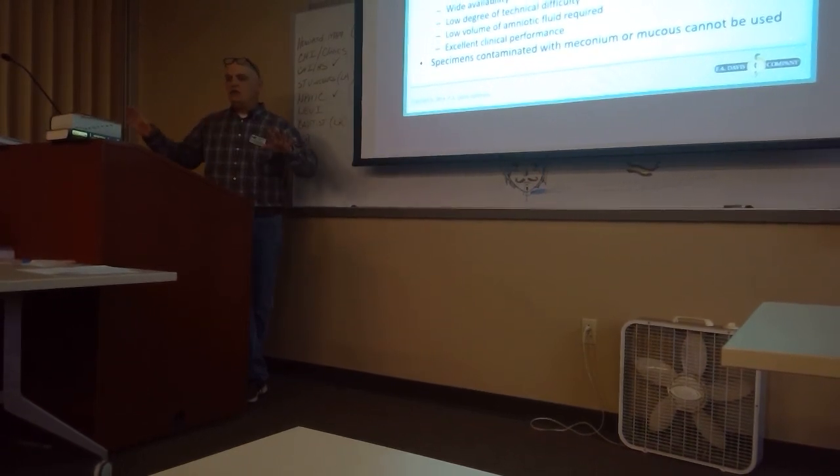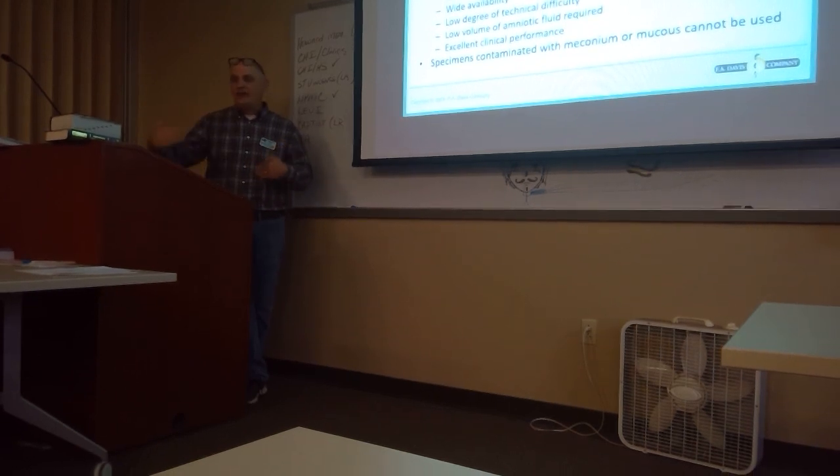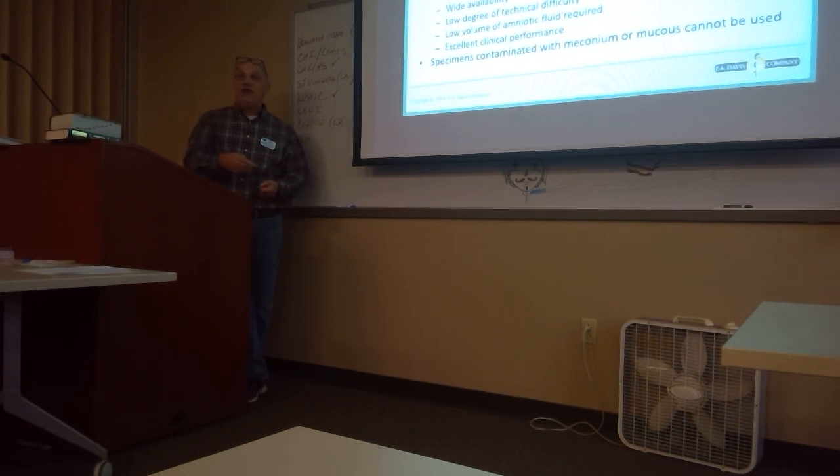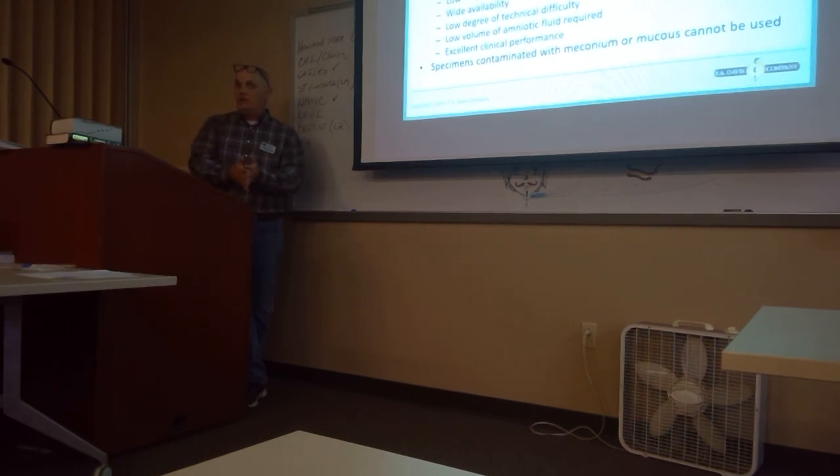I'm not going to test you on any of those numbers, but basically what I want you to know is you can take amniotic fluid and run it through a CBC analyzer and it will count those lamellar bodies as platelets, okay? So if you wanted to do a real quick lamellar body count, you could go over to whatever analyzer runs CBCs, run it through that machine, and don't pay attention to anything but the platelet count, because the platelet count will tell you how many lamellar bodies are in that fluid. Isn't that pretty neat? It's just a quick way. And lamellar bodies indicate the storage form of surfactants, which can correlate with fetal lung maturity, all right?